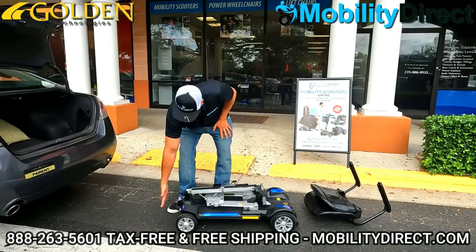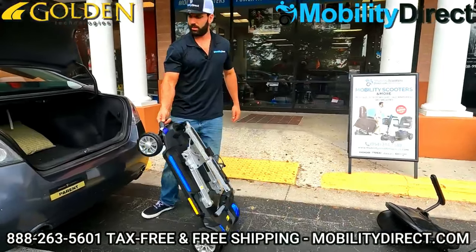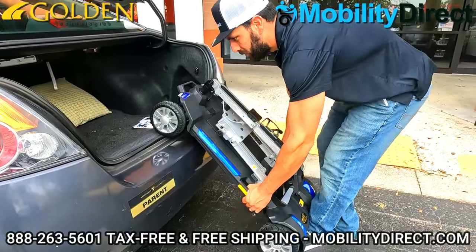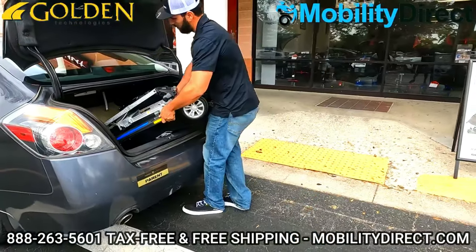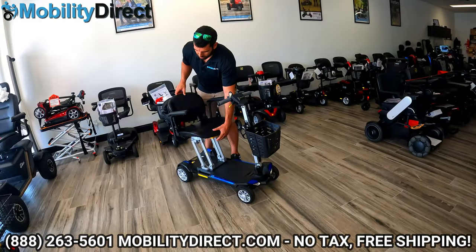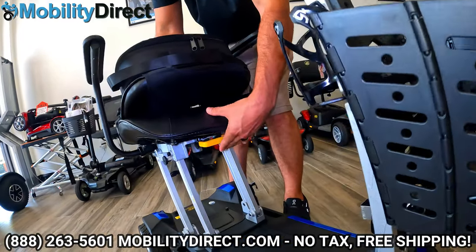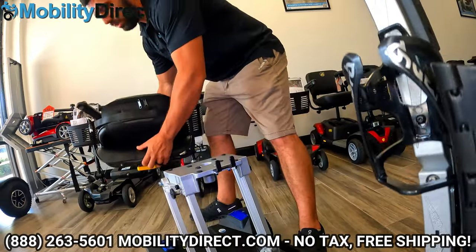What's nice about those handles is that they are towards the middle of the base, so when you're grabbing onto them, it's going to help you with leverage to roll it into the trunk of your car. As we take it apart — all you have to do is fold the backrest down, depress the yellow lever underneath the front of the seat, and pick straight up. The seat comes right off.